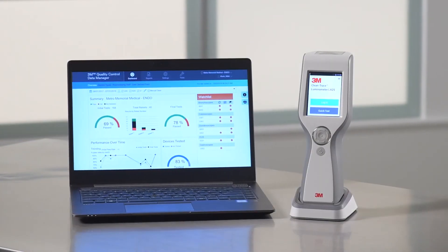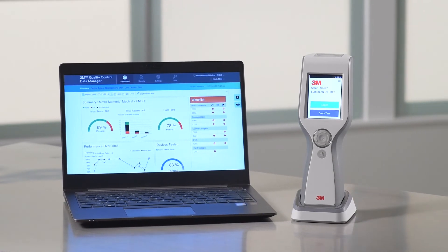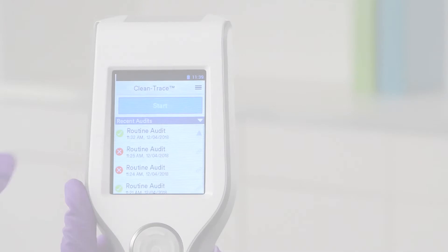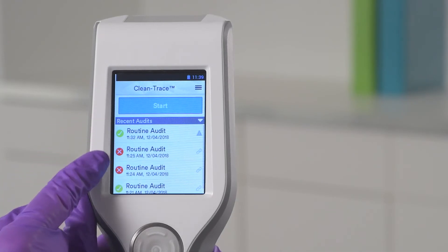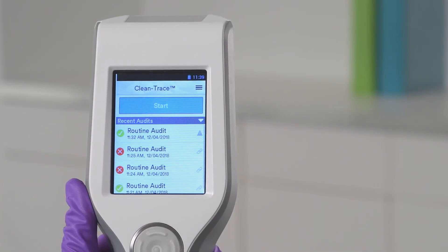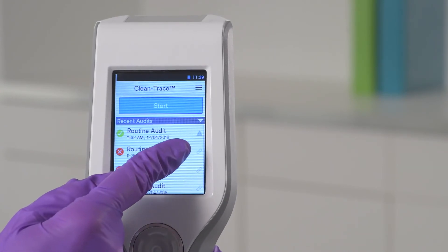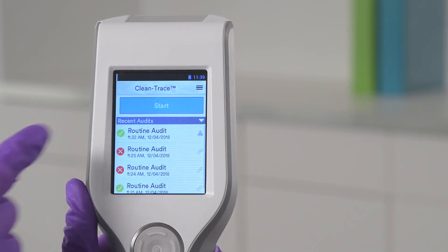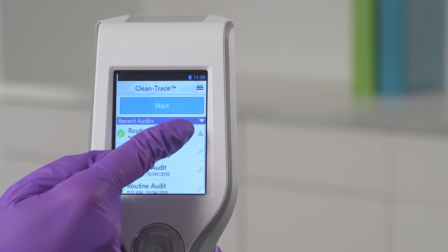Your results can be uploaded from the Luminometer to the 3M Quality Control Data Manager, or QCDM. To verify that your data uploaded to QCDM, look at the recent audits listed on your Luminometer. A link icon will appear after a successful upload. An unsuccessful upload will result in a triangle with an exclamation point.